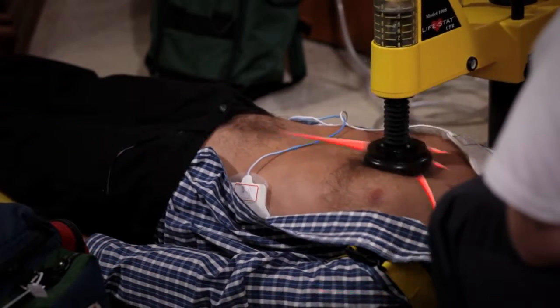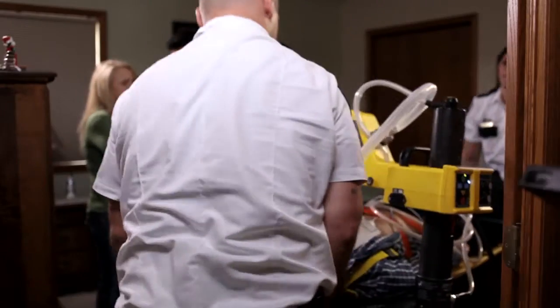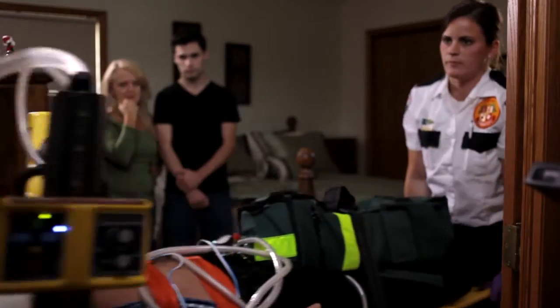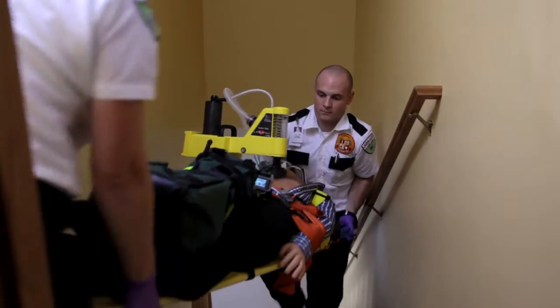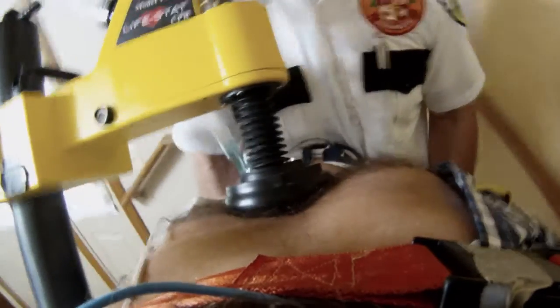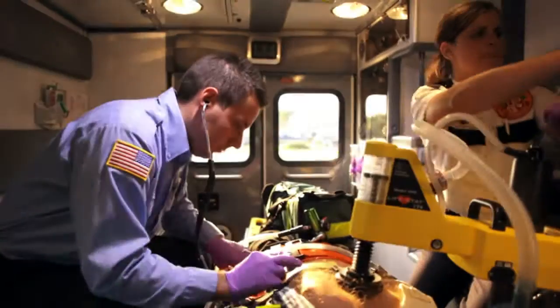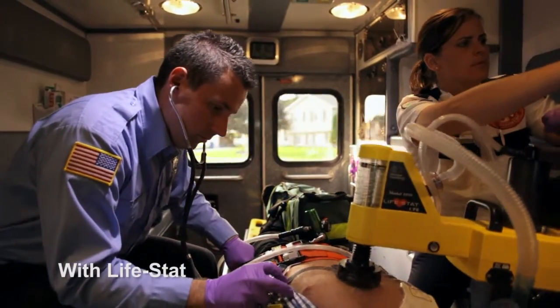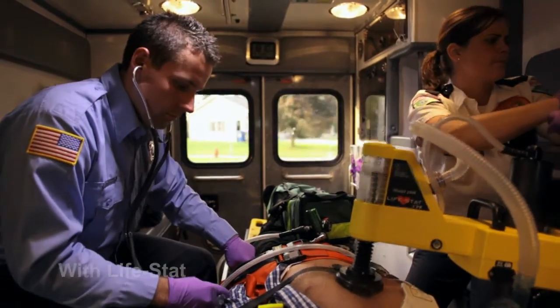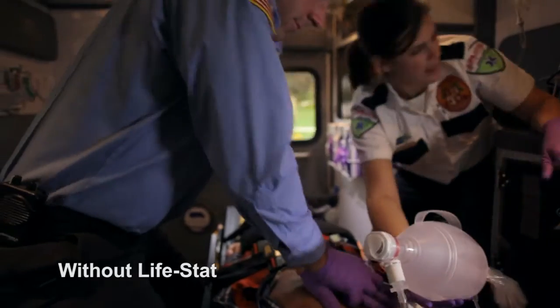Cardiopulmonary resuscitation plays an important role in creating and maintaining adequate perfusion pressure. The Lifestad delivers consistent, perfect compressions and ventilations to the victim, even in situations where traditional CPR is nearly impossible to perform. Lifestad allows paramedics to work more efficiently and in a manner that is safer while traveling in the back of a speeding ambulance.